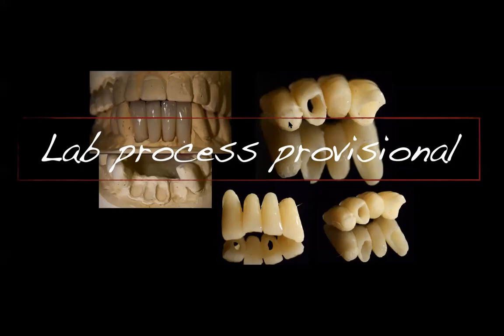Anybody want to shout out why I decided on the cantilever? It's the close proximity sometimes to the teeth. If you're too close to a natural dentition, you will not have the parallelism that you want to your other implant. So in a lower anterior, where I have type 2 or sometimes even type 1 bone, I opt to create and have a cantilever where I can keep my parallelism between my two implants perfect.